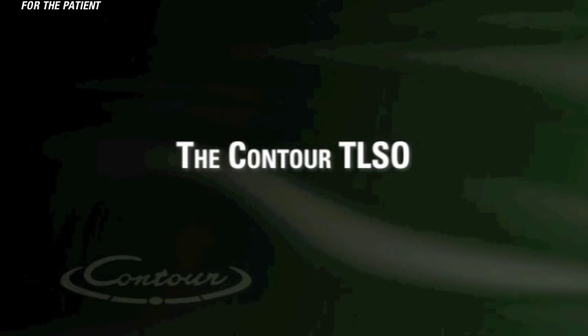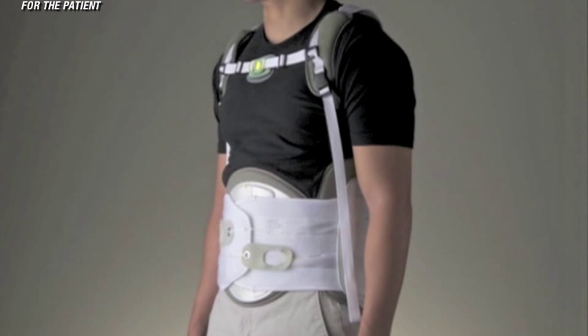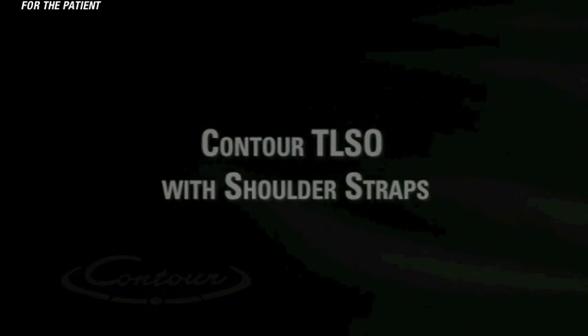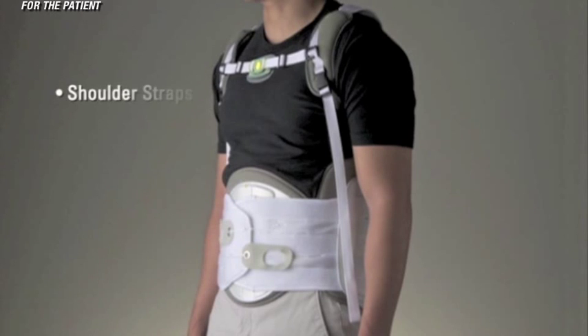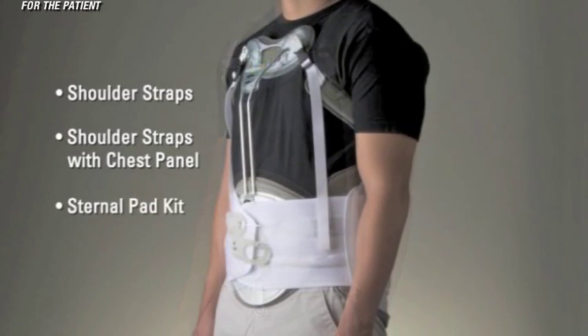The Contour T LSO. When even more support is needed, the Contour LSO can be stepped up to a Contour T LSO. There are three possible configurations of the Contour T LSO depending on the condition: shoulder straps, shoulder straps with chest panel, or sternal pad kit.